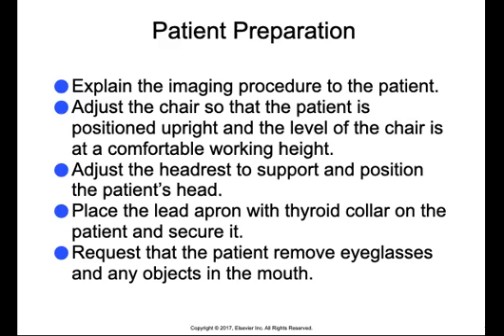So for maxillary occlusal exposures, the patient's head must be positioned with the maxillary arch parallel to the floor and the midline perpendicular to the floor. For some mandibular occlusal exposures, the patient's head must be reclined and positioned with the occlusal plane perpendicular to the floor. And in others, the patient is positioned with the occlusal plane parallel to the floor.